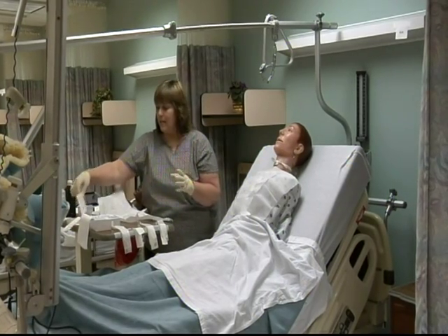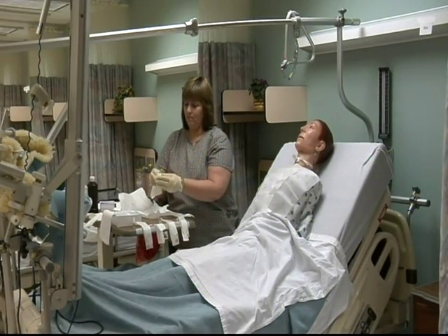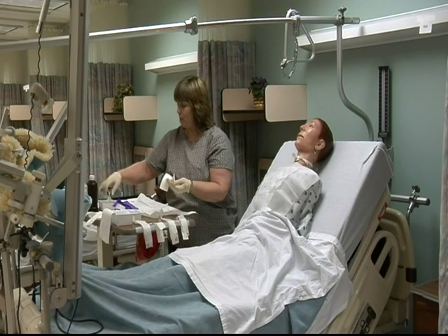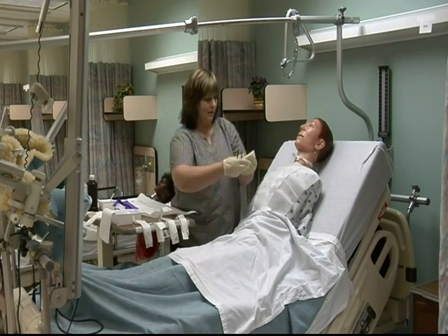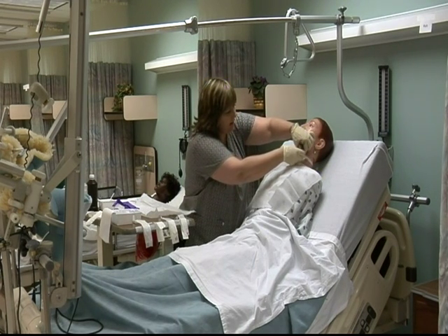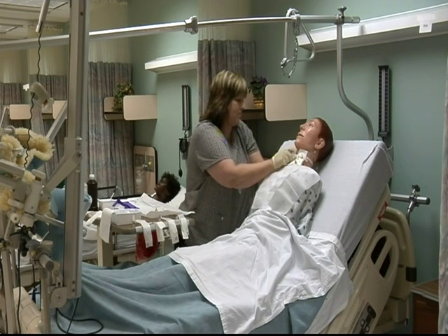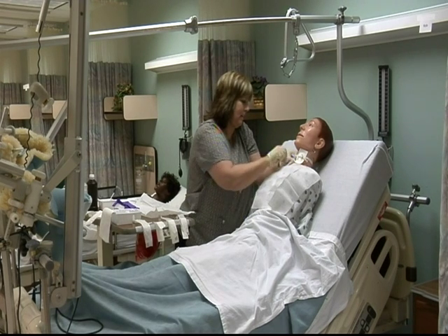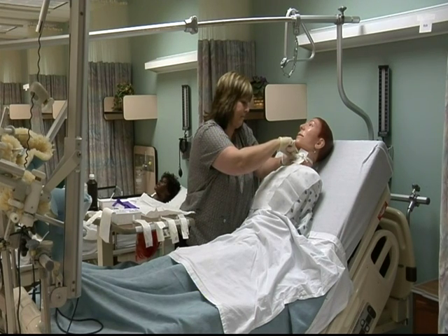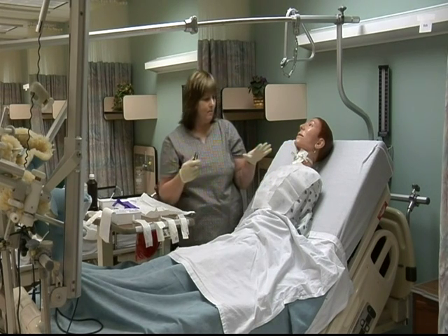So now we need to take our drain sponge, and you can actually use your forceps that are in your little package that you removed from your kit. What we're going to have to do is slide this under the trach itself. So this is like a drain sponge to catch all that drainage. Careful not to wiggle it too much. Now that is Trach Care.